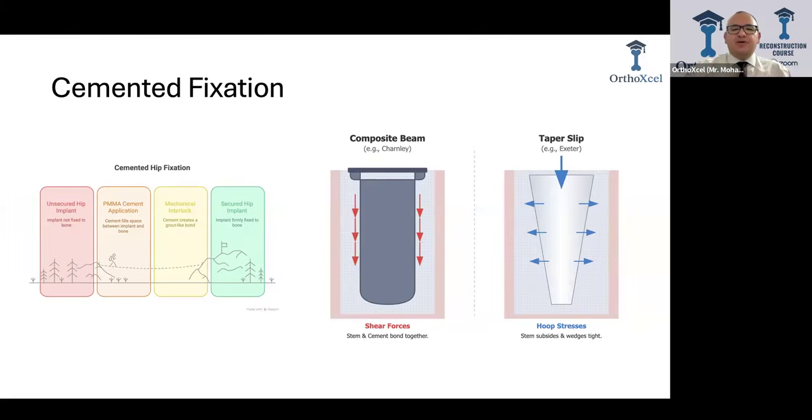It could be uniplanar, biplanar, triplanar, a double taper, or a triple taper. Taper means there is a differential diameter between the proximal and the distal end of the implant. This could be on one plane, which is one taper, in two planes, which is a double taper, or in three planes, which is a triple taper. Plane means sagittal, coronal, or axial.